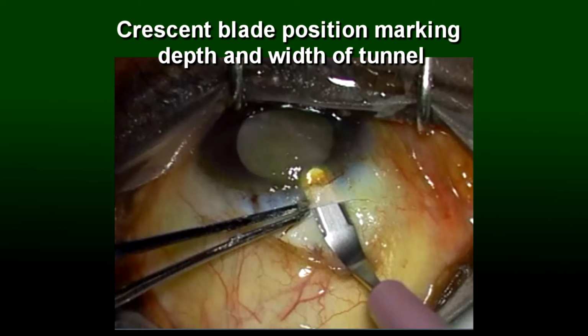The crescent blade, you can use to get a sense of the width of the tunnel, because the crescent blade is about 6.5 millimeters from here to here. So if you want a 3.5 millimeter wide tunnel at the center point, if you go about half the length of the crescent blade, you've got a good marker on how far you want it to go.